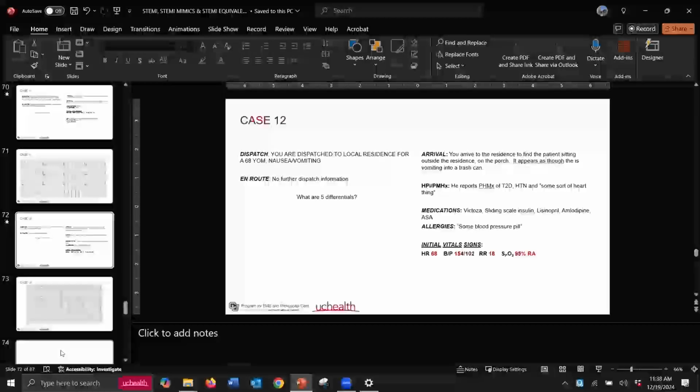Okay. We're going to do one more. You're dispatched to a local residence for a 68-year-old male, nausea and vomiting. No further dispatch information. What could it be? 68-year-old nausea and vomiting. Food bug. Could be one of many, right? What do we know we're going to do? We're going to do all of our diagnostic capability, right?